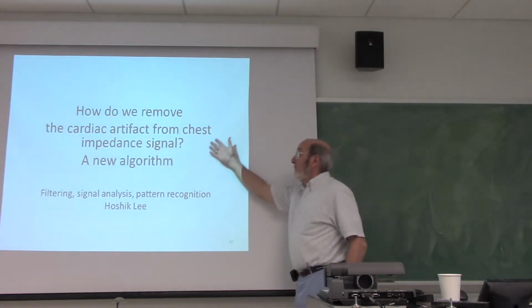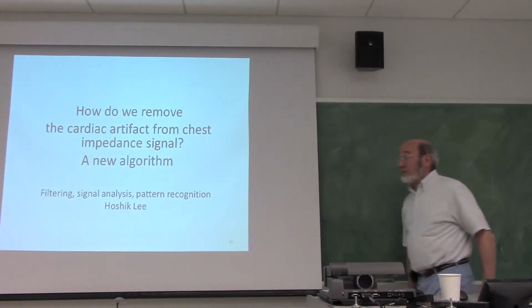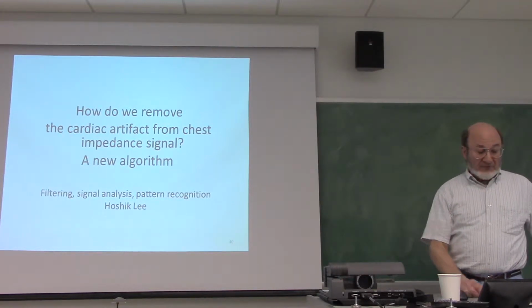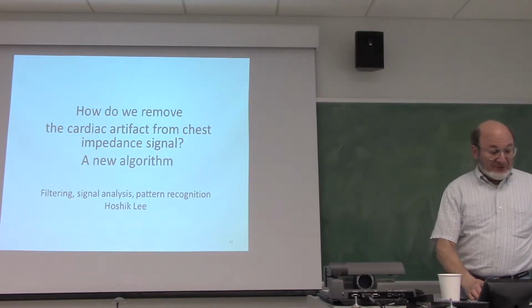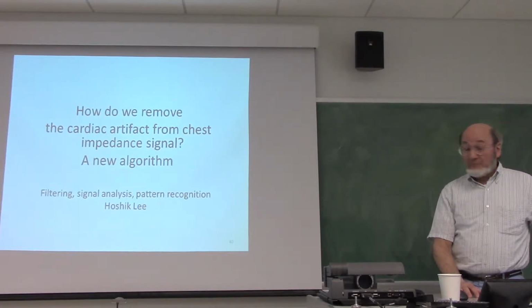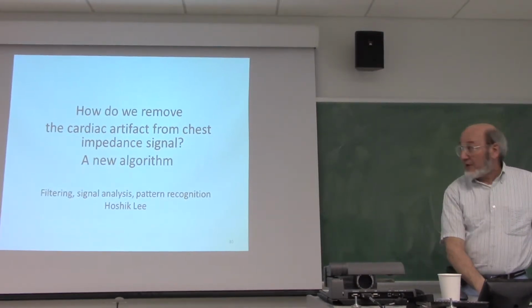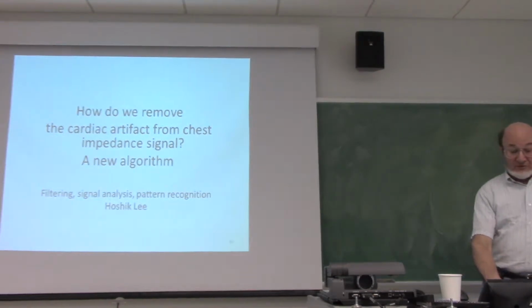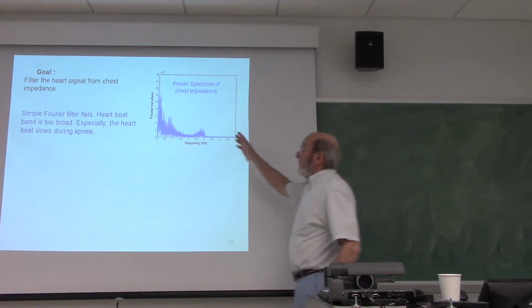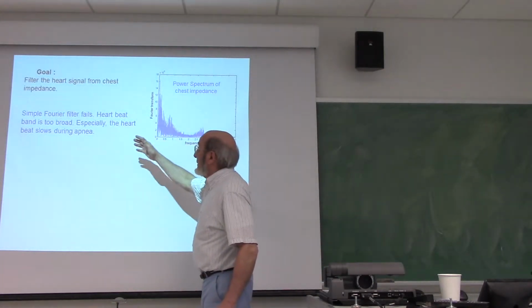Well, how do we remove the cardiac artifact from the chest impedance signal? We developed a new algorithm. There's again a job for physicists, mathematicians, computer scientists, a problem of filtering and signal analysis, pattern recognition. I had a wonderful postdoc named Hoshik Lee who developed this method. Goal: filter the heart signal from the chest impedance.